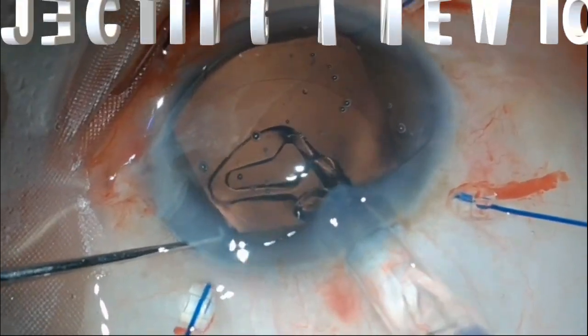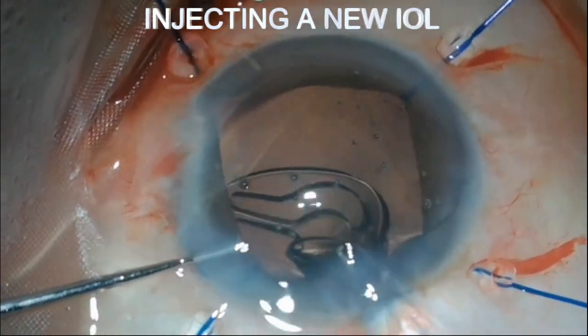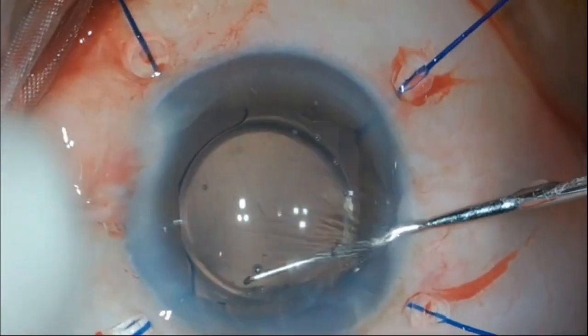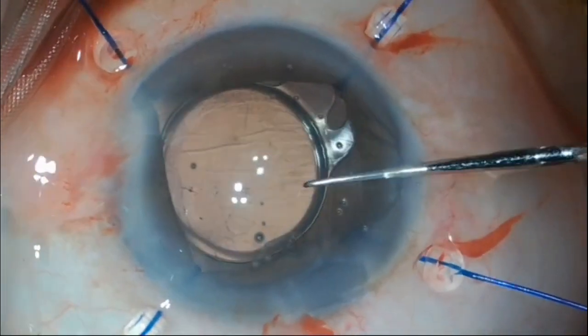The second method is you can cut the optic into multiple pieces and remove single piece at a time. Take-home message is training juniors in surgeries requires keeping one's eye peeled for patient safety. Be patient and be vigilant.